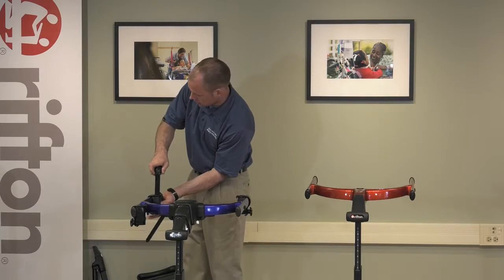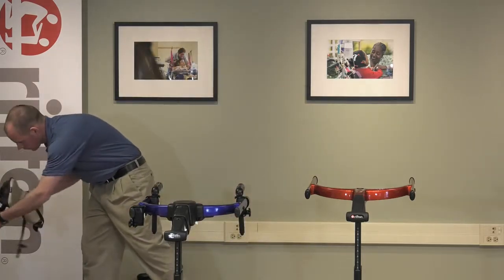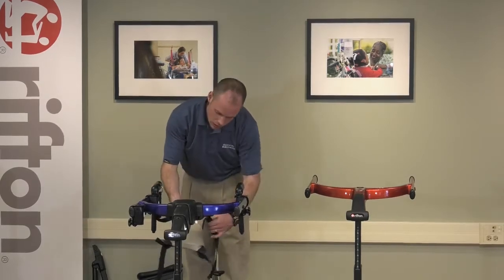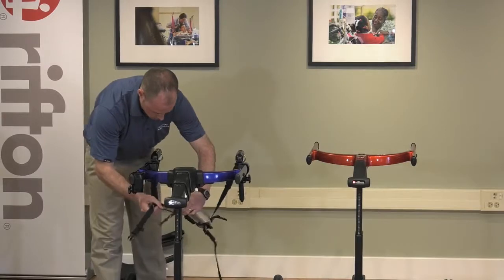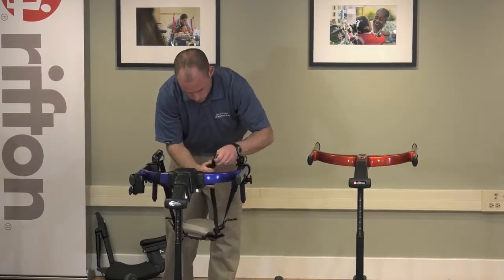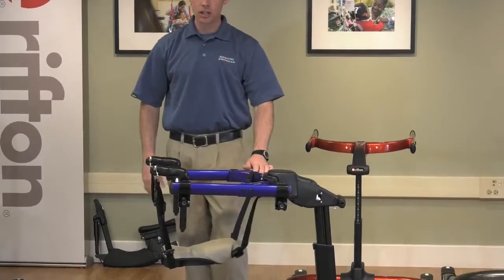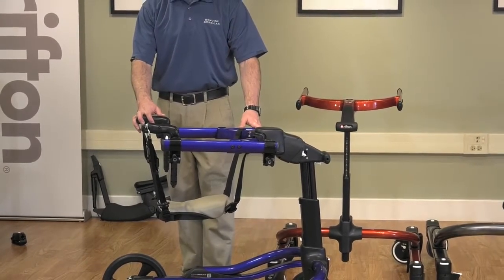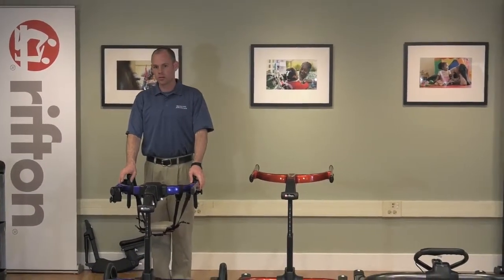So you just put the handholds in at the back here, just like before. Clip your hip positioner in. And then fasten it onto the front of the pacer like that. So it still works just the same way for you. Does that answer the question? Any other questions still?